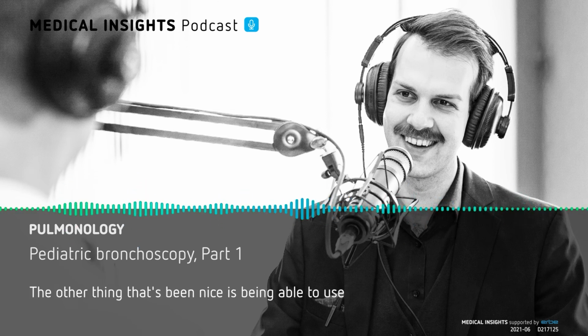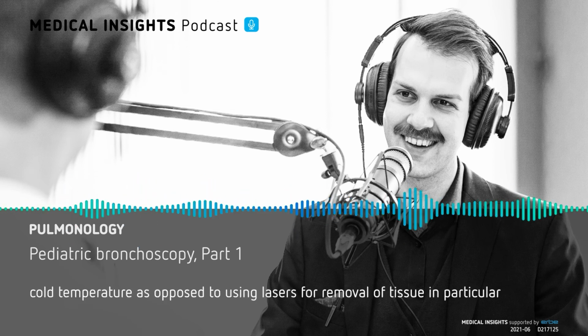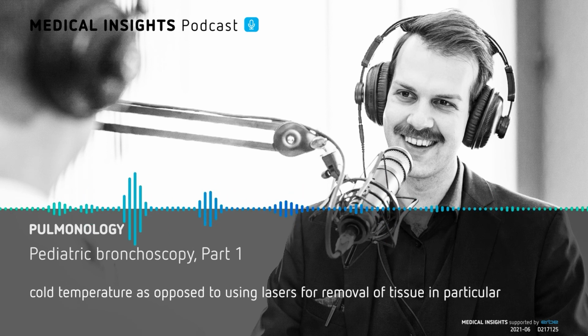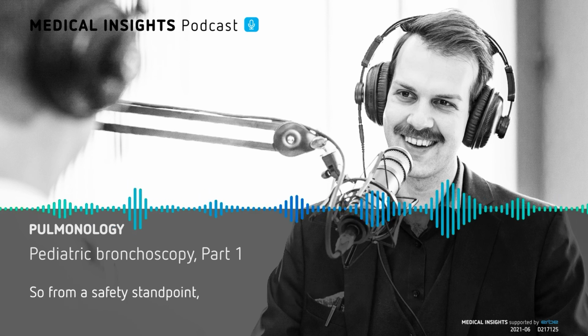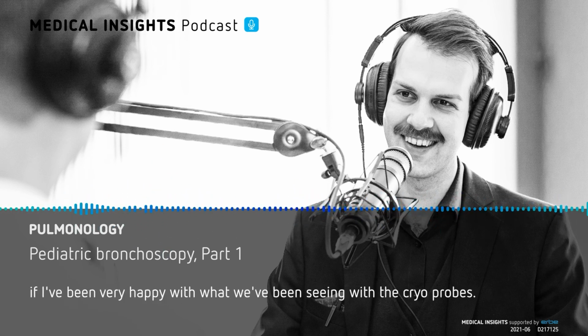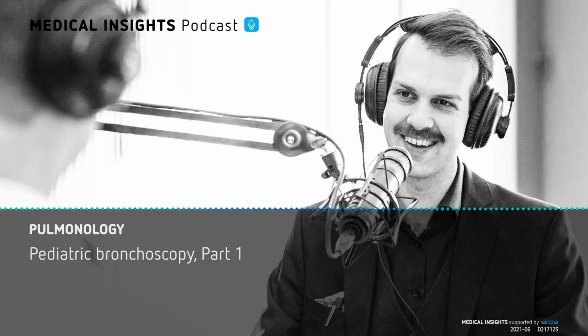The other thing that's been nice is being able to use cold temperature as opposed to using lasers for removal of tissue in particular, because we haven't had any problems with airway fires. So from a safety standpoint, so far I've been very happy with what we've been seeing with the cryoprobes.